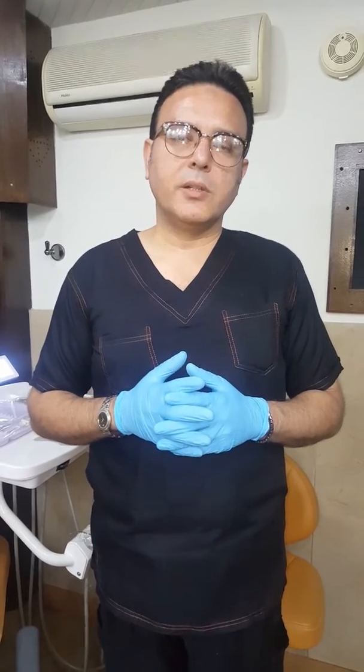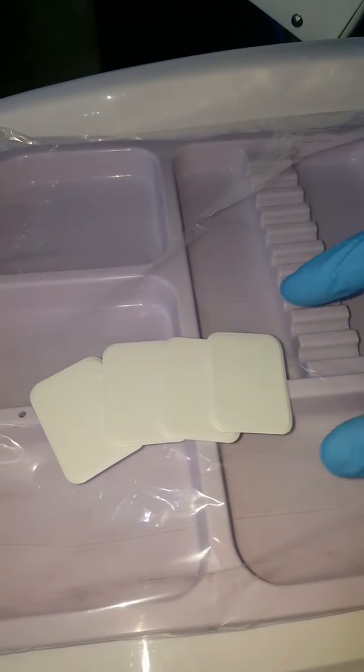Welcome to California Care. Today we are going to show you a little survey radiography on pediatric patients. This does not by any means cover the whole mouth, but for a little survey on pediatric patients I will recommend these four films and how to take them. So, of course, we have four films right here.